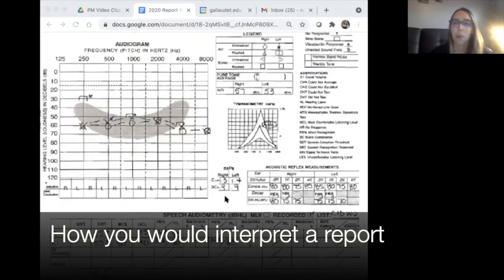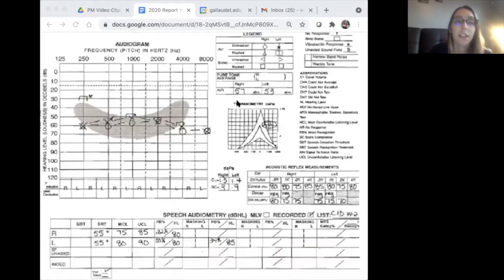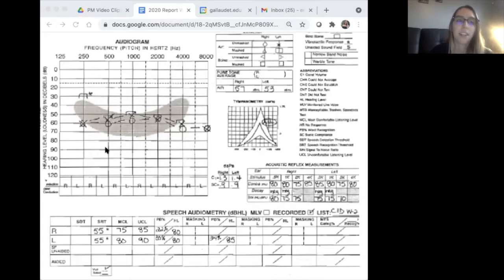Here we have an example of an interpretation. We would say otoscopy revealed visualized tympanic membranes and clear ear canals bilaterally. Tympanometry revealed normal middle ear pressure, mobility, and ear canal volume bilaterally, so type A's. Acoustic reflex thresholds down here were within normal limits in both ipsilateral and contralateral thresholds, and the acoustic reflex decay was found to be negative across 500 and 1,000 hertz. Pure tone audiometry was conducted via the ER3A insert earphones. Testing revealed a moderately severe rising to moderate at 1,000 hertz, then sloping to moderately severe in the higher frequencies, sensorineural hearing loss bilaterally.